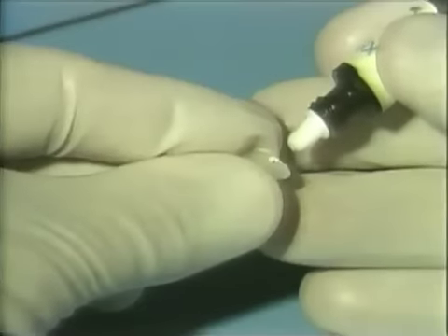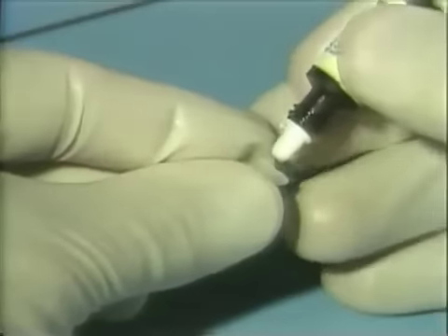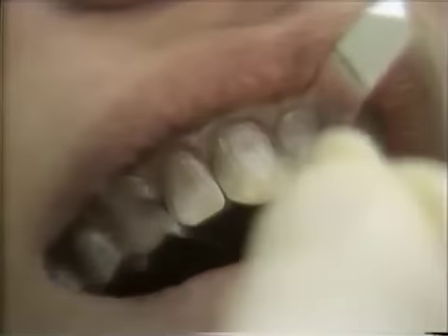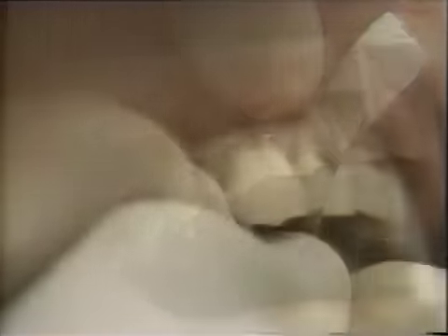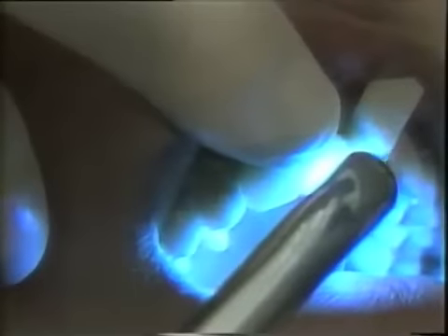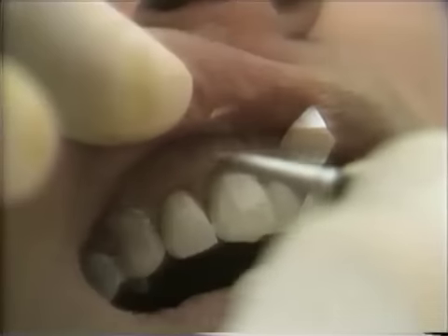The laminate has been treated with silane and the bonding agent. Next we place the untinted resin on the surface and place it in the mouth. We are placing the loaded laminate on the tooth, incisal first, gently seating it and forcing the excess out. A brush is used to take the excess away from the cervical, and then the laminate is gently seated and more excess is removed. Excess is taken away from the incisal; floss can be used to take excess away from the interproximal. It is cured on the incisal, then the cervical excess is removed again, and the cervical is cured after this excess is removed.